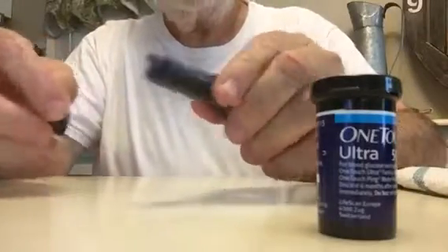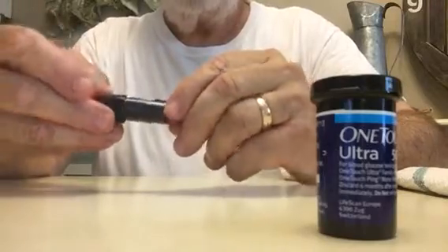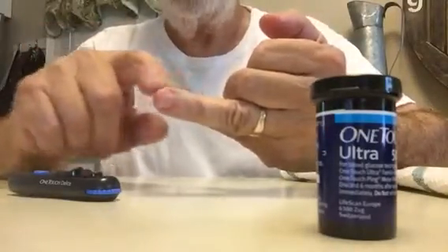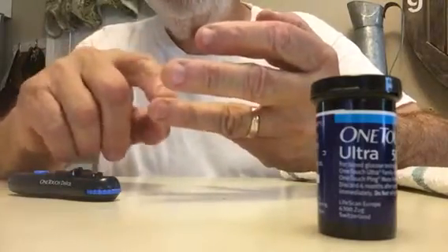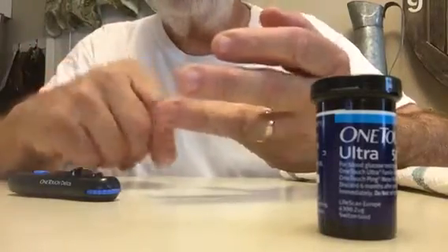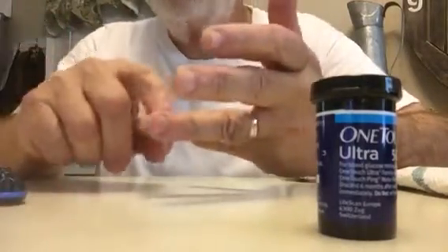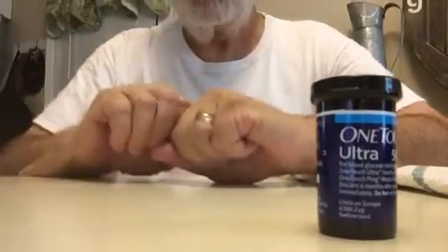I've already loaded my device for pricking my finger. I use a setting of four, which is kind of a light setting. Interestingly, the first layer on your fingers is skin, then blood vessels, then nerves. The idea is to keep adjusting the setting to where it never really strikes the nerves.